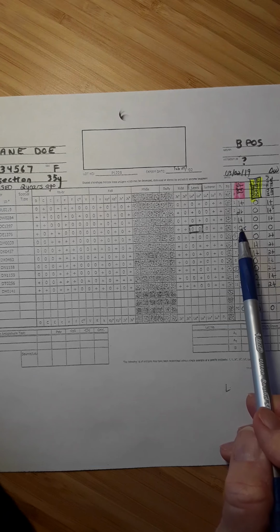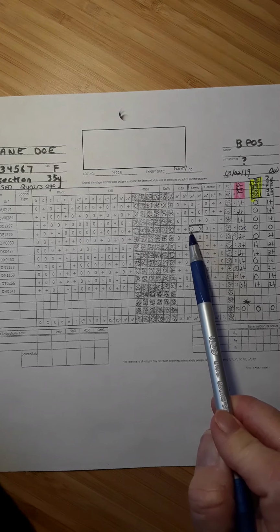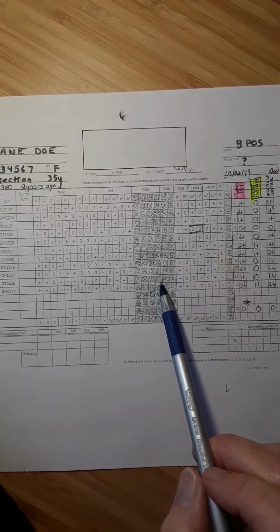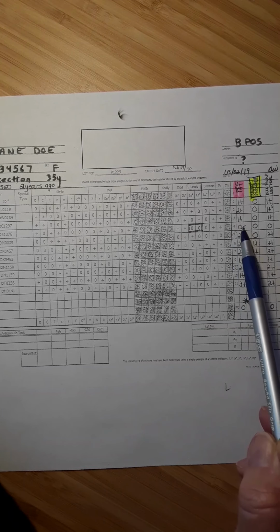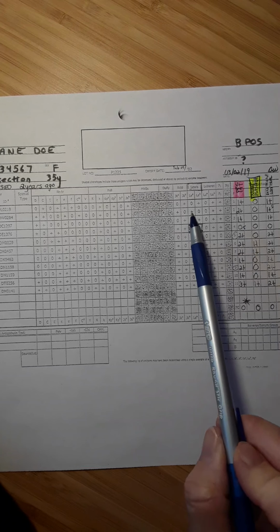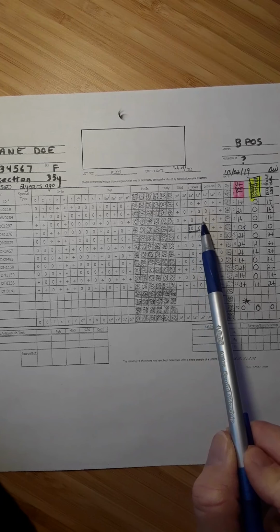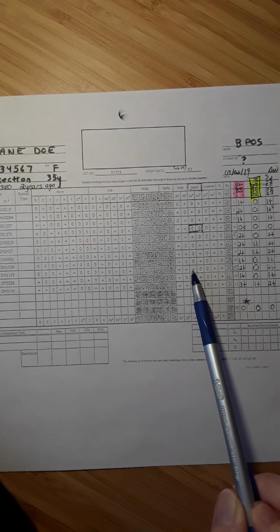So no reaction of the patient's plasma with a cell that doesn't have Lewis A or Lewis B on it. So basically, that little piece of information there is what got me thinking this patient has produced an anti-Lewis A and an anti-Lewis B. If you look at every other cell, it has one or the other on it, either the Lewis A or the Lewis B. So at this point, just a hunch.